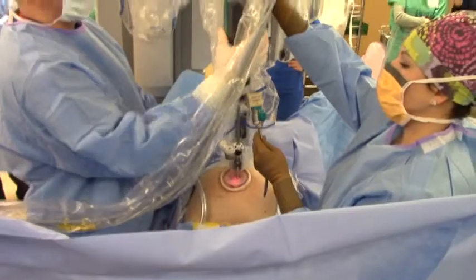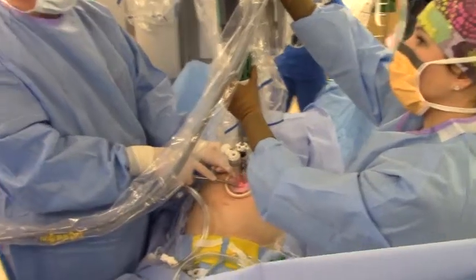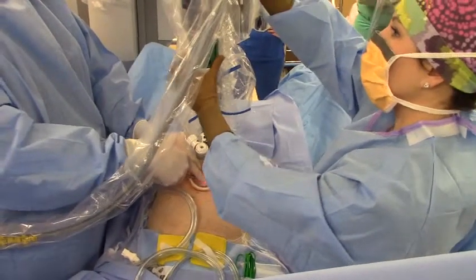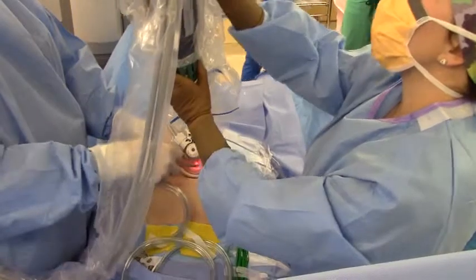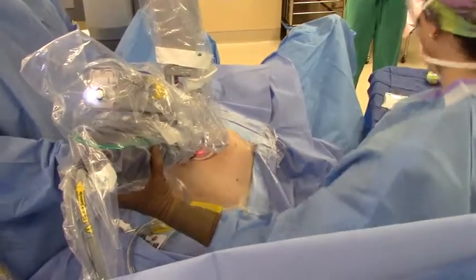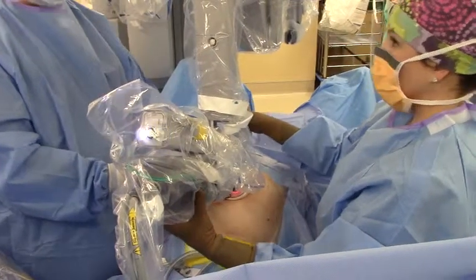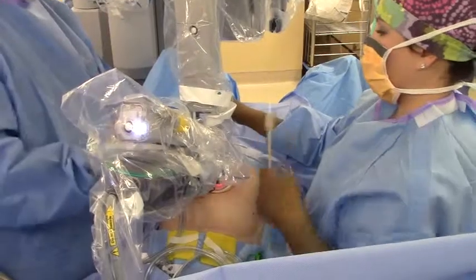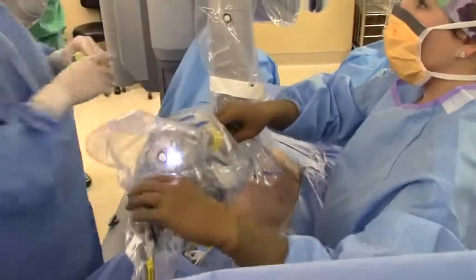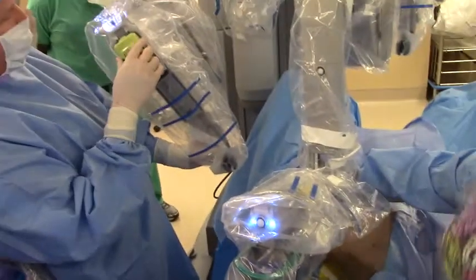You're opening the finger and giving me a little finger to the lower side. And you love doing it with the down scope — is that correct? Correct, the scope is down. How is that different from doing it with the up scope? It's the same amount of space. It's just that we don't have to stop and turn the scope around — all those little minutes saved. So if you do your posterior portion of the colpotomy with the down scope, the anterior with the down scope, and then if I need to, I can swap those three up.